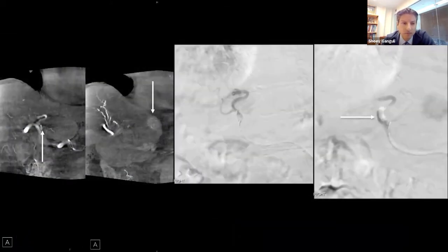And these caudate lesions where the arteries come from can be variable, can be small, and it actually came off this left hepatic artery. There was a very small vessel there. And we really wanted to just get radiation into that tumor. We were worried about possibly accessing this or dissecting it.